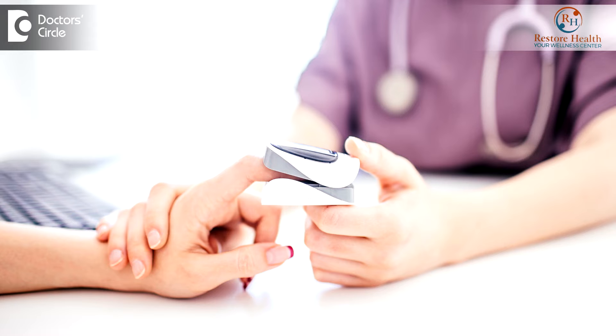All you need to do is put it on your index finger or the middle finger, preferably the right hand, and switch it on. It shows you the level of oxygen saturation in your blood and also gives you the reading of your pulse. Once you fix it on your finger, keep it there for about half a minute to a minute. It will show you a reading immediately, but that's not the correct reading — wait for a minute and it will show you the exact, correct reading for your oxygen saturation.